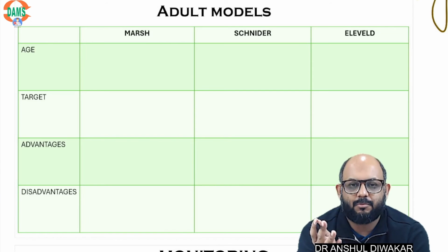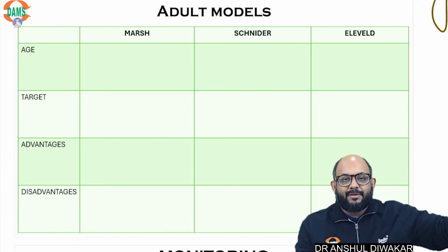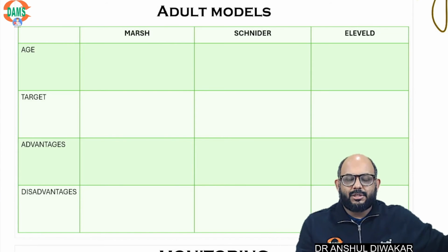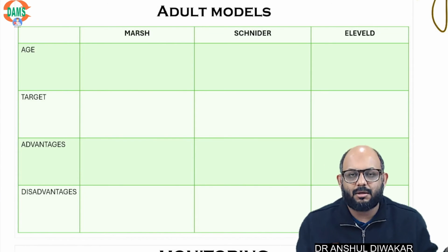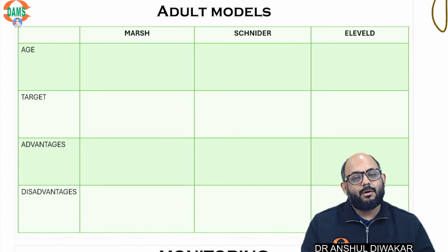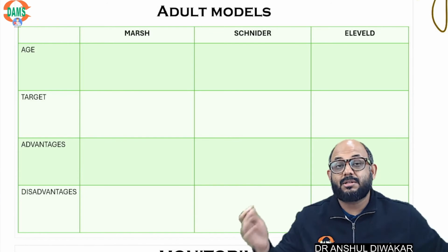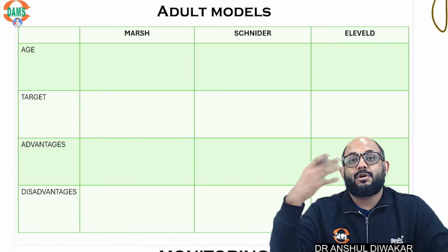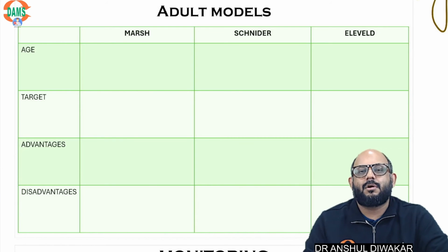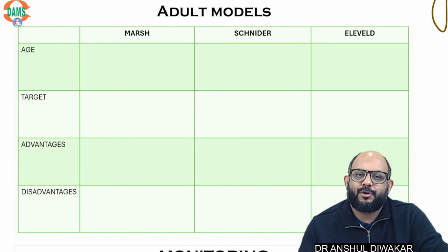BET model, 3-compartment model. Now what did people do? They sat down and started doing experiments in normal individuals. They took a large subset of the population, say 20 years to 80 years, and they started giving different infusions either for achieving anesthesia or for sedation, unconsciousness, looked at the recovery profile, looked at accumulation, looked at a lot of durations, whether for short surgery, long surgery, induction, complications, everything, and on that basis they worked on certain models, and these models were then fed into the software of the TCI.